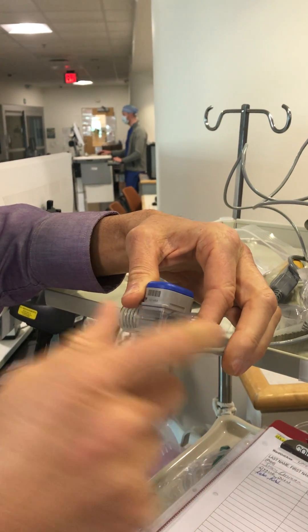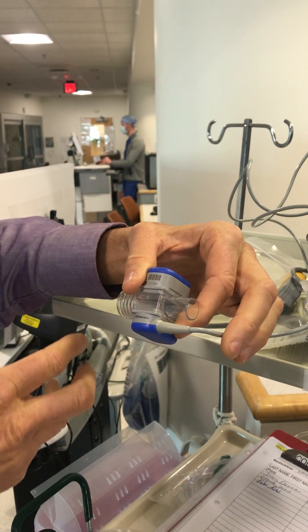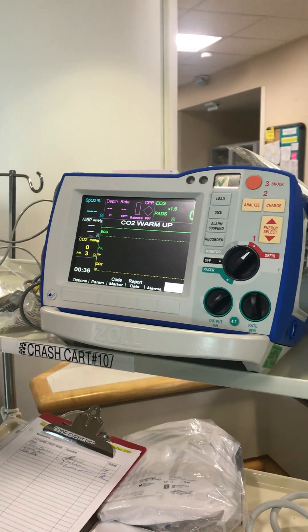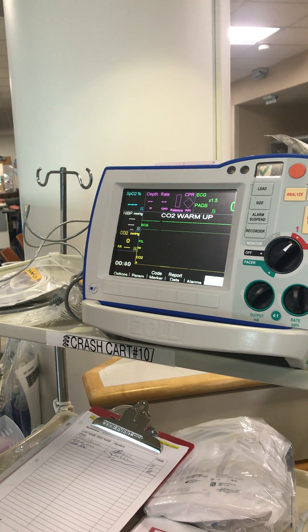This is where your Ambu bag would go. This is where your tracheal tube would go. Once you have a tracheal tube or a trach or something, it's pretty obvious who goes where. This takes a few seconds to warm up, but as soon as you've got it warmed up, when in defibrillator mode, it'll display waveforms and numbers for your CO2.